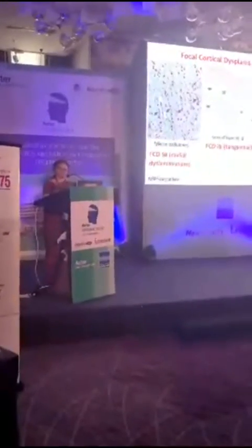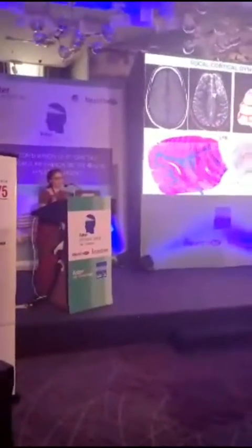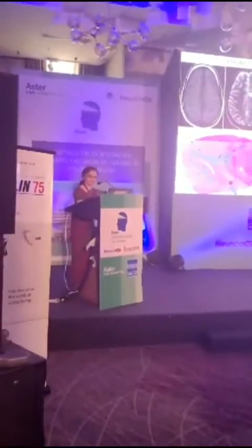So just for you to keep in mind, this is normal lamina architecture where you have a 6-layered architecture, alternating granule and pyramidal, and this is what gets disrupted in FCD type 1. You call it an FCD type 1A when this radial dyslamination is there. A horizontal one, where there's a missing layer, is the tangential, and the 1C is both. Now, it is believed that 1C was just put in there because if you have radial and you have tangential, there's a possibility that you can have a 1C, but nobody till now has reported a 1C. Those are again MR negative, and you have to depend on a pathologist to give you the diagnosis.